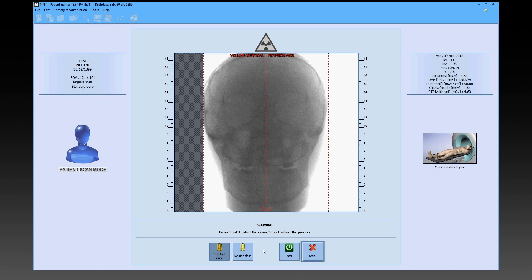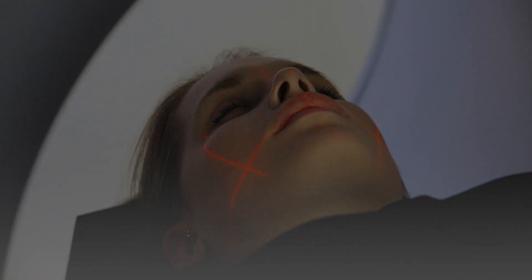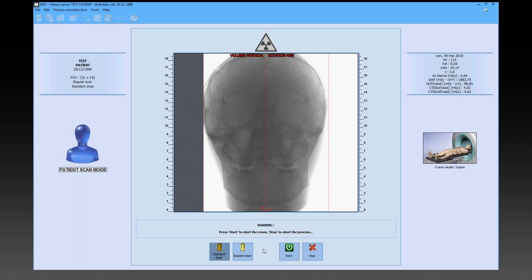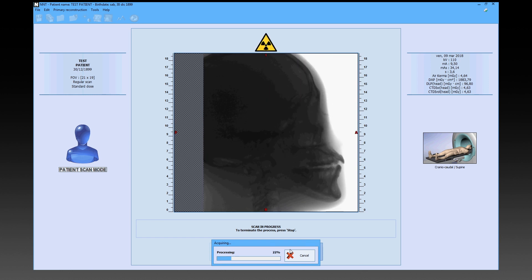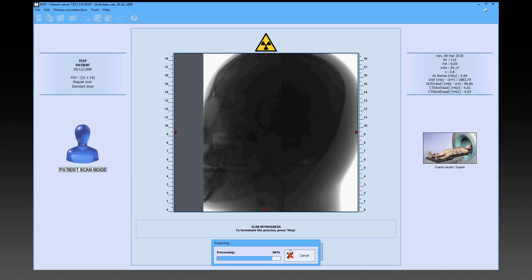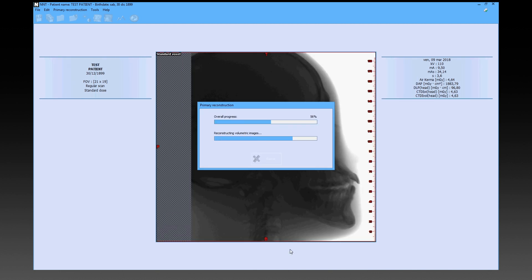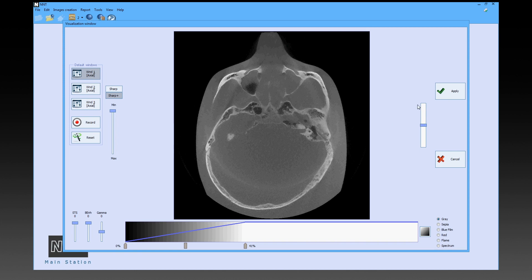The stop button allows the whole capturing procedure to be stopped at any time. Before starting the scan using the start button, the patient should be asked not to move and to breathe through her nose. During the scan, the scanning progress can be monitored on the PC. At the end of the procedure, the file is automatically stored and it is possible to check the scan using the special buttons.